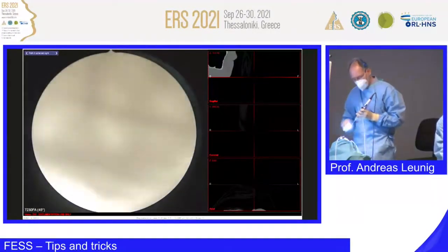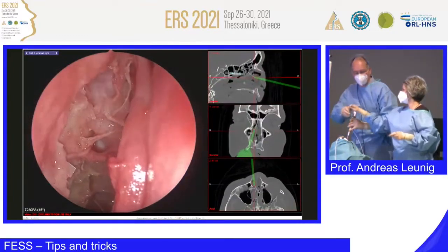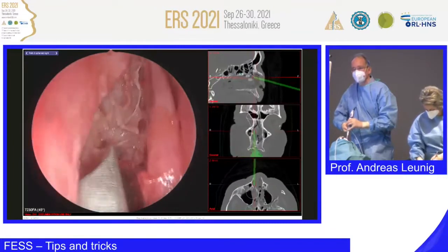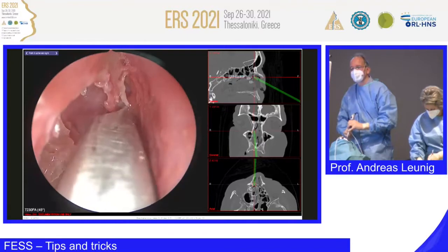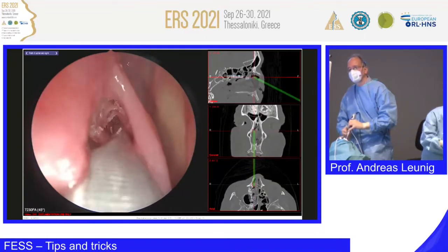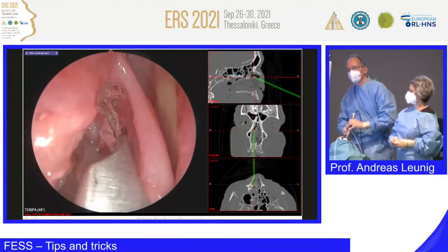Now, I don't want to tear mucosa out of this area. I want to do a sharp dissection. And I show you one of my favorite instruments. They are fantastic. Because it's looking like a crocodile, I always call it crocodile. I go here and I nibble it away. And you should have it in your setting because it gives you a lot of support in the concept of functional surgery.